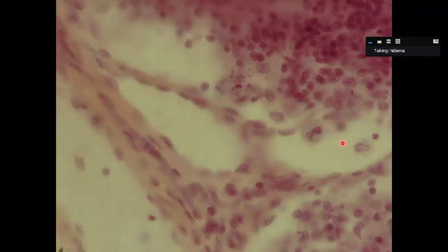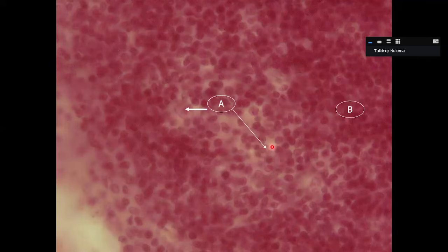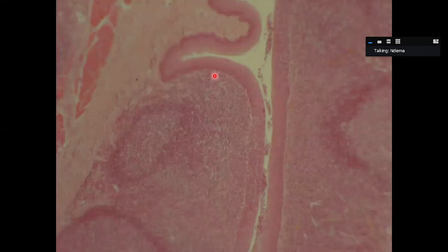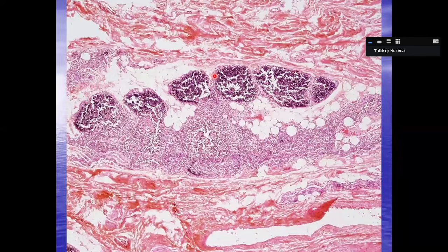This is just a capsule showing the endothelial lining of the sinuses. And here are reticular cells that produce reticular fibers. This is the reticular fibers. Notice the network formed by reticular fibers for the reticuloendothelial organs. This, I think, is familiar, the palatine tonsils. Hassall's corpuscle at high power.